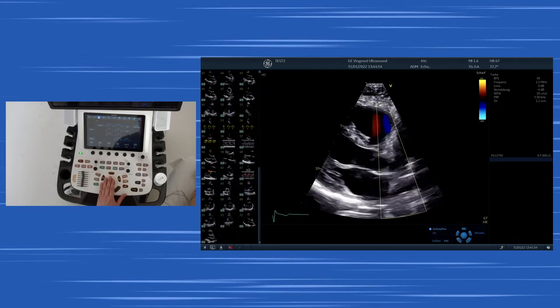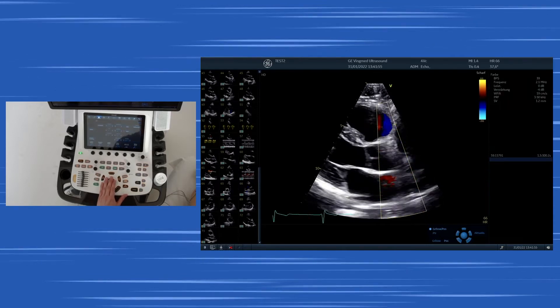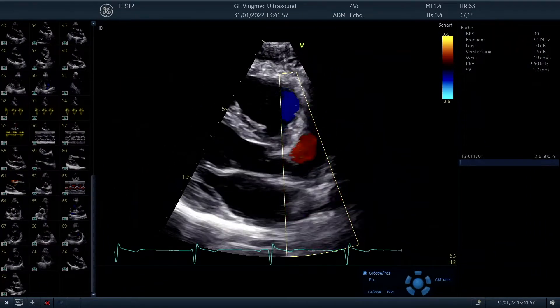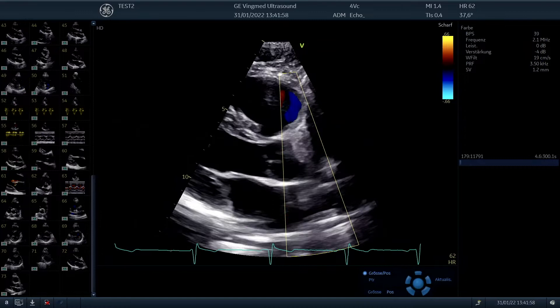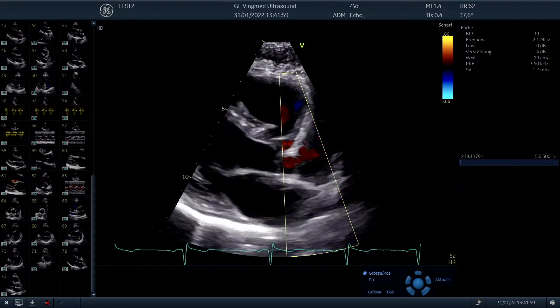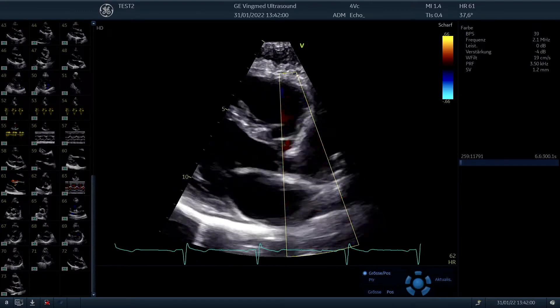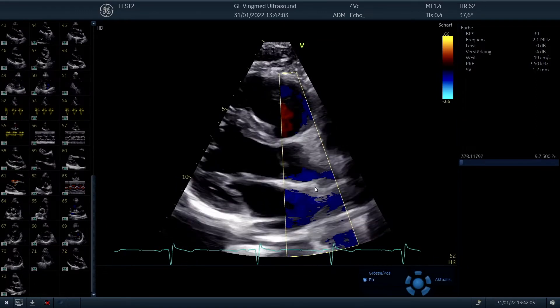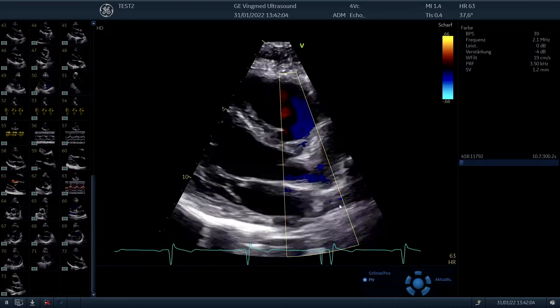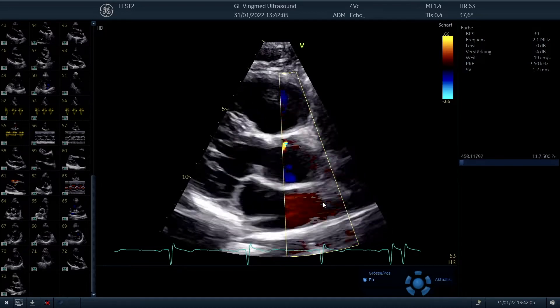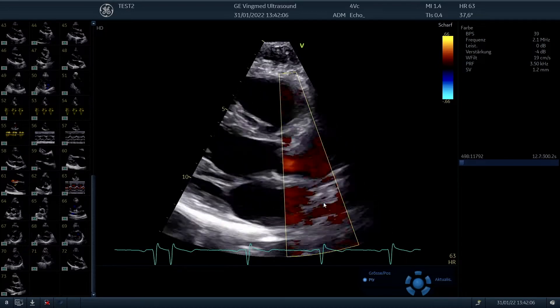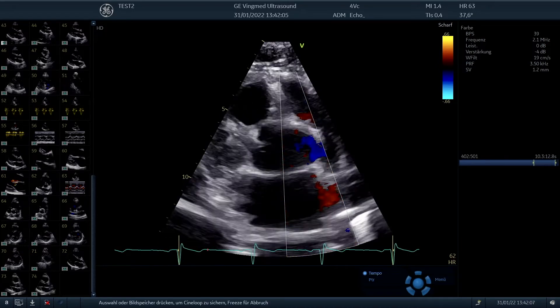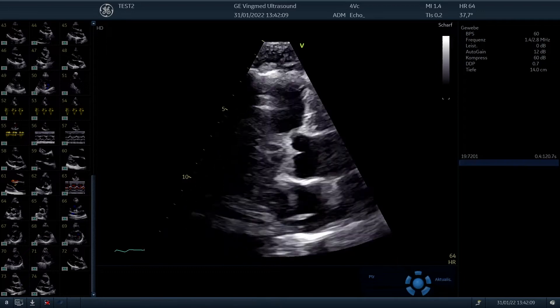What we can see, if we apply color Doppler, are two structures entering the left atrium which are the pulmonic veins. You can see them over here entering the left atrium. So it's even possible in the parasternal long axis to display the pulmonic veins.